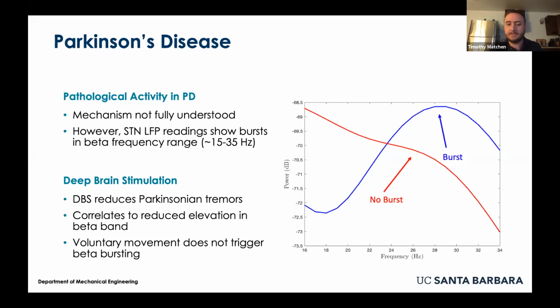Since these patients are also on medication, they can experience overstimulation from deep brain stimulation, as they'll get these dyskinetic effects from the interaction between the DBS and their medication, while at other times of day, those effects aren't as pronounced, and it's more just mitigating the bradykinetic effects from Parkinson's disease. And of course, as the patient continues to age, their underlying physiology can change as well.